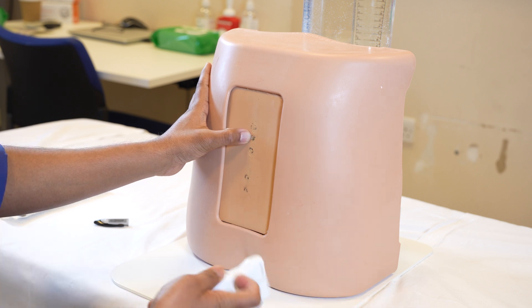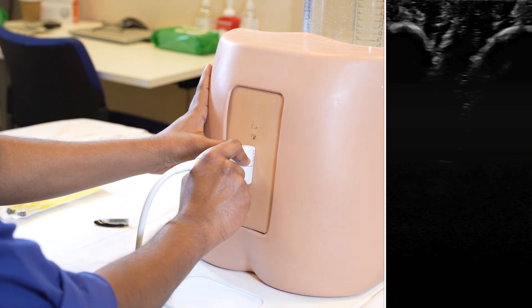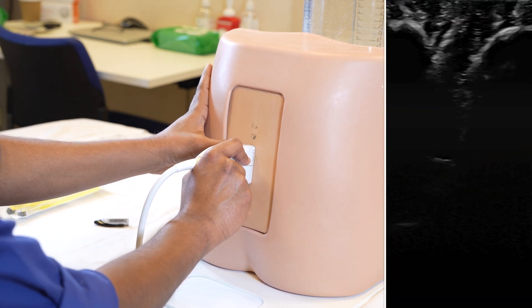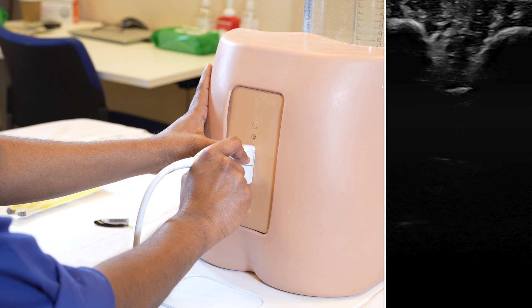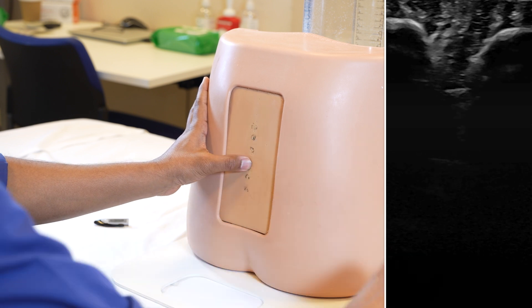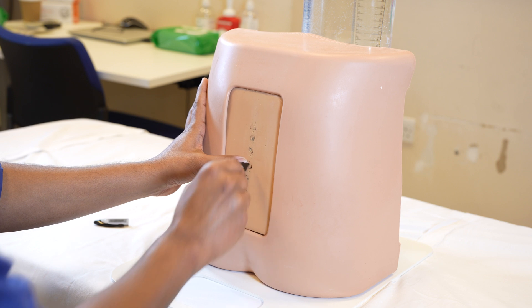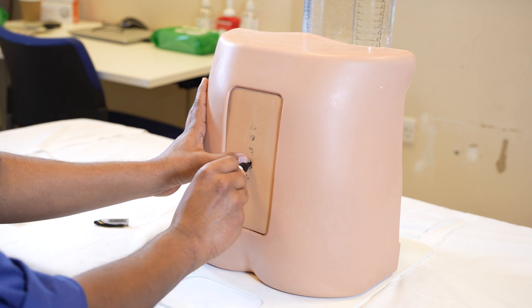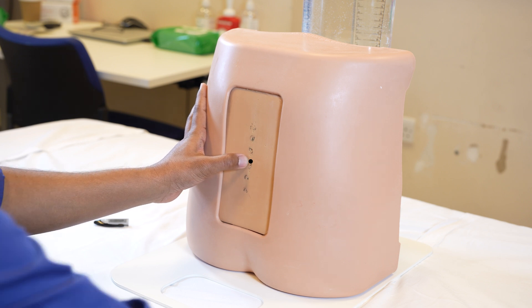If we wanted to go for L4 and L5, we can repeat the same thing. Place the probe longitudinally to capture the L4 and L5 spinous process in the same screen, with both humps visible. We will have the midpoint of the L4 and L5 spinous process in the middle of the screen. Once we have that, we put our thumb there to capture the exact point and mark it — giving us the LP needle insertion point at the level between L4 and L5.